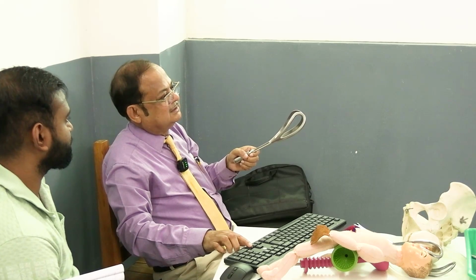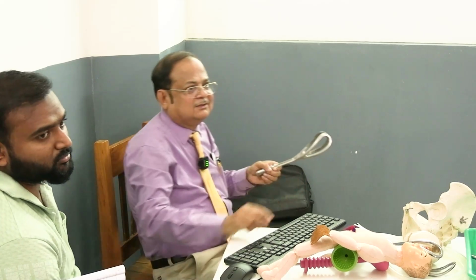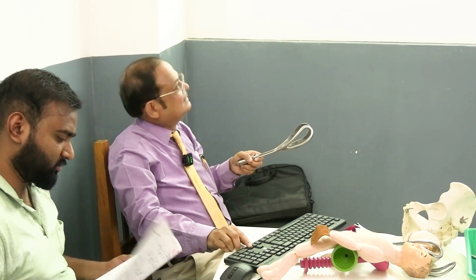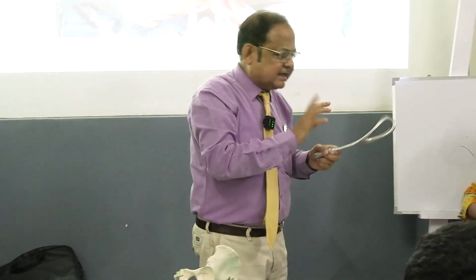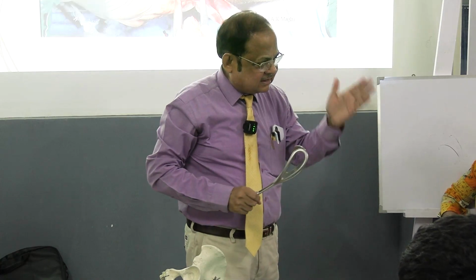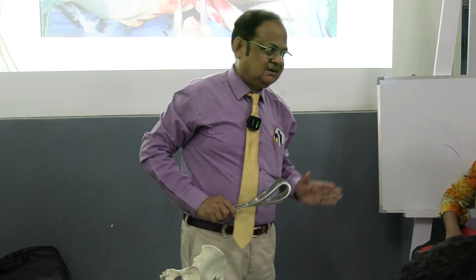ওই স্টিল ফিল্মগুলো যেটা দেখেছো, traction is giving। তারপরে traction বল। মুখস্থ করেছিস সবাই, মুখস্থ না, মুখস্থ বুঝতে হবে। Traction giving during the height of the contraction, I have already said. Contraction comes and contraction passes off, during contraction you give the traction, both in case of ventouse and forceps.